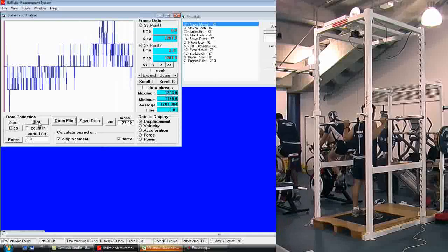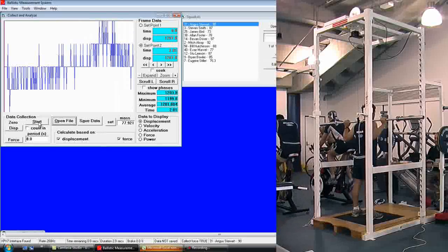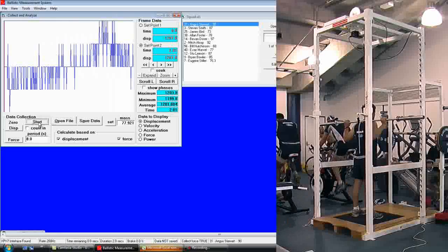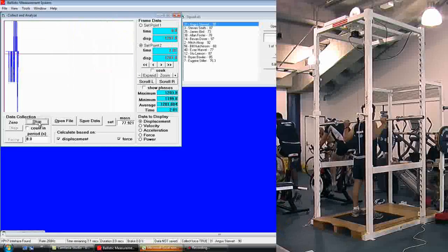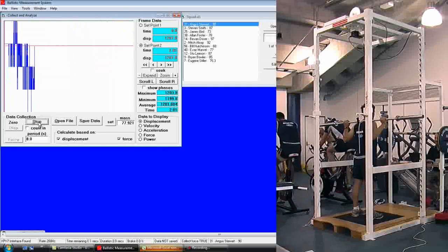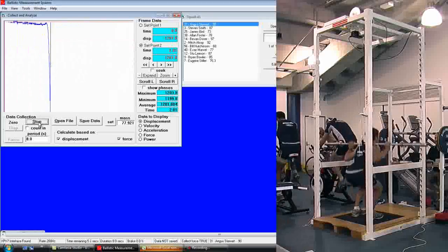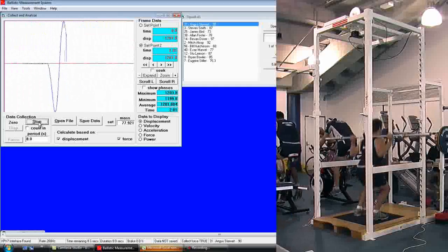We then click the Start button and allow a portion of flat graph leading, and then tell them to go.